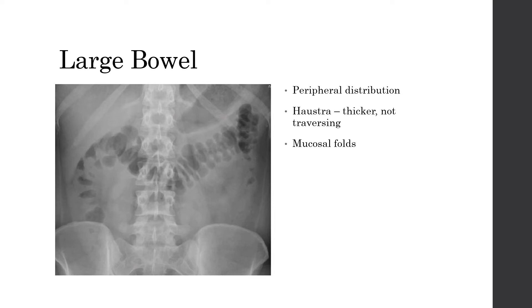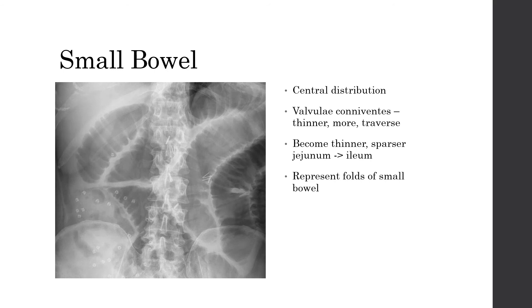Now we're going to look at some normal patterns of gas. Here is an image that shows the large bowel quite well — we can identify it by looking for haustra, which are the mucosal folds of the large bowel. They are thick and do not traverse the lumen. Large bowel is normally peripherally distributed, however in pathology such as obstruction where the diameter increases, it can take up the whole film. Comparing to the small bowel, the folds are thinner and traverse the diameter of the lumen — these are called valvulae conniventes. They generally become thinner and less frequent as we move from jejunum to ileum, and the small bowel tends to have a central distribution.